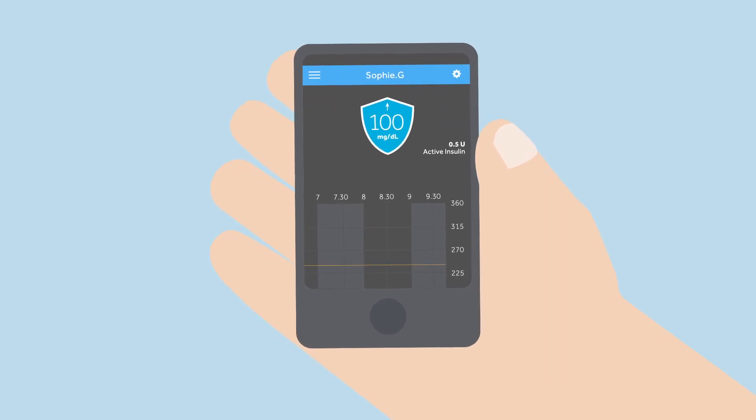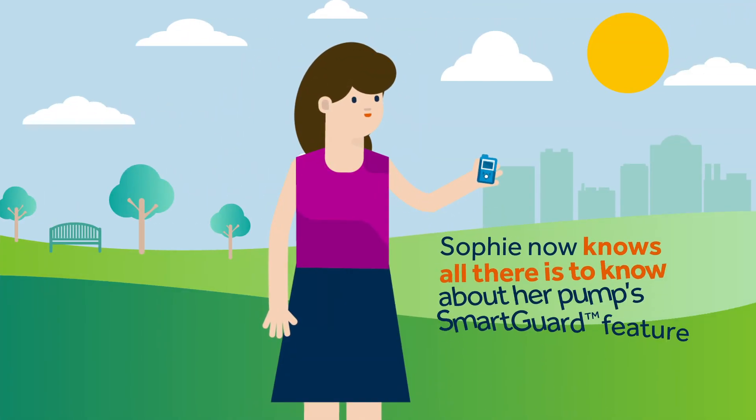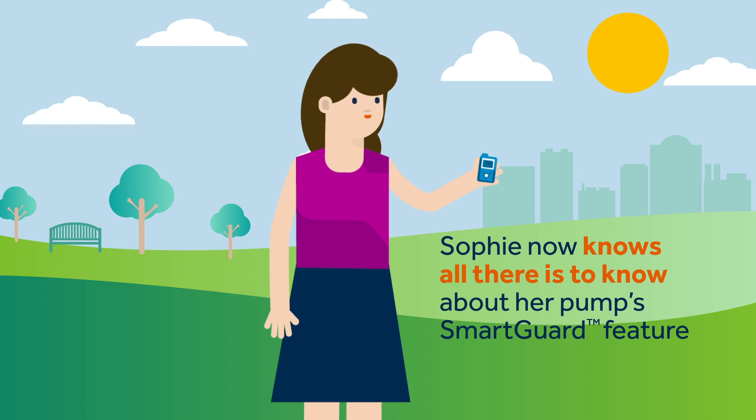Kelly suggests that Sophie connects with care partners so that they can see her pump and CGM data and receive notifications. Her care partner just needs to download the CareLink Connect app and request to follow her. Sophie now knows all there is to know about her pump's SmartGuard feature and is ready to start her journey with her MiniMed 780G system with the SmartGuard feature.